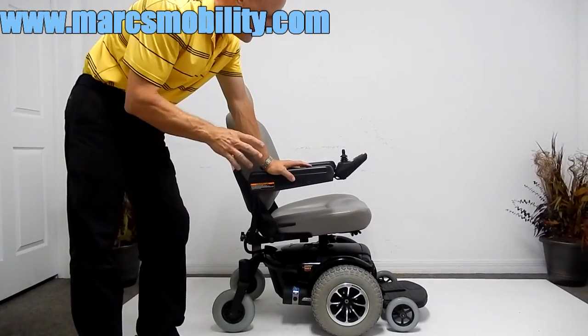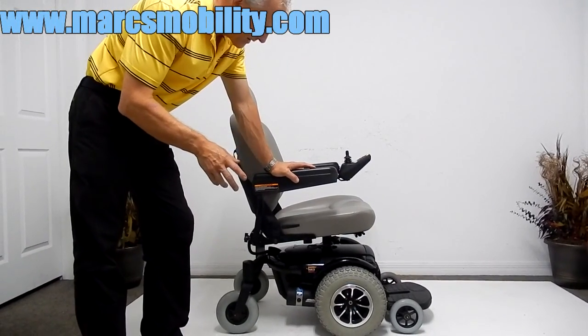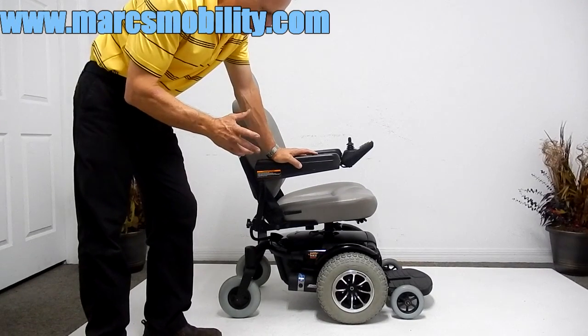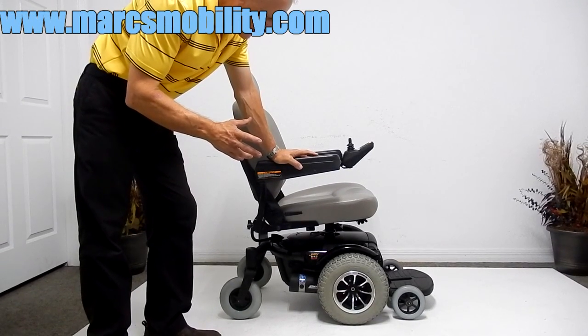This is a Jazzy 1143 Ultra. This is a very hard power chair to find, for a simple reason — they didn't make that many. They only had them for a few years.